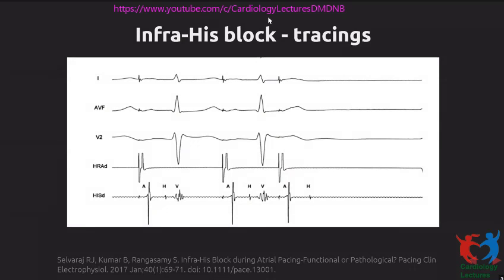So this is a patient, we're doing an EP study. What we do is atrial pacing. These are 2 beats of atrial pacing, and this is an atrial extra stimulus. So during the atrial extra stimulus, like I told you, the His bundle electrogram records an A, His, and a V. And here you see A, His, and then no V. So this is a block happening below the His. Now, this is infrahisian block, but this is not an indication to pace.